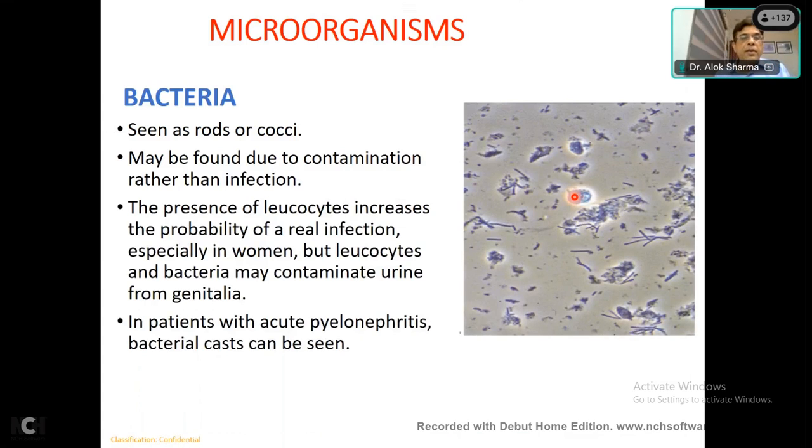So we're done with most part of it. The remaining thing is you should not ignore the bacteria. The bacteria can arise as contamination. If you hold the urine for too long, they can proliferate there, although they may not be pathogenic per se in the patient. But nevertheless, you should be able to identify and note their presence, abundance, and give a note, right? So if you are examining a urine which has been kept for a lot of time, just make a note there that I'm examining a urine which has been kept, and this may reflect a contamination or an overgrowth, but don't ignore it, right? Always document the bacteria.